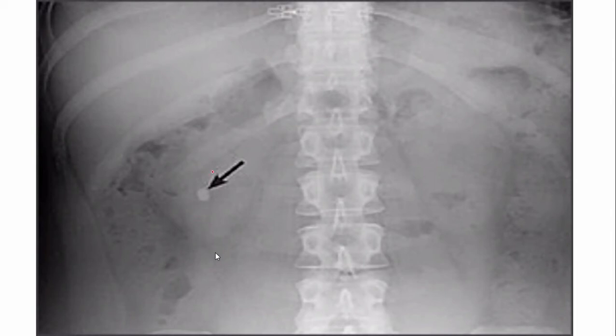So that is a simple stone. Look at this, doctor. This is actually a kidney. The shadow that you see, it's a kidney. So that is a simple stone. That is not a staghorn type. So that's a calcium stone.